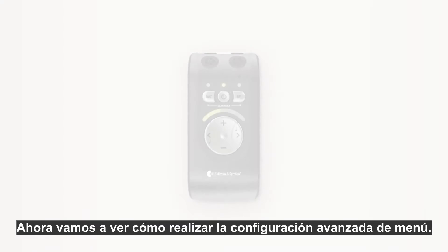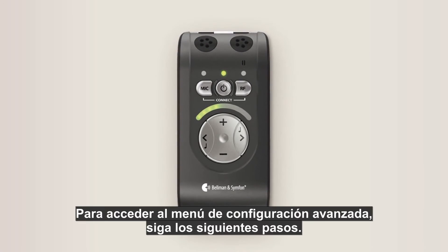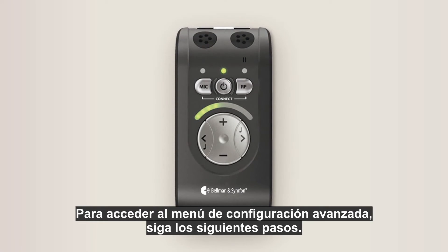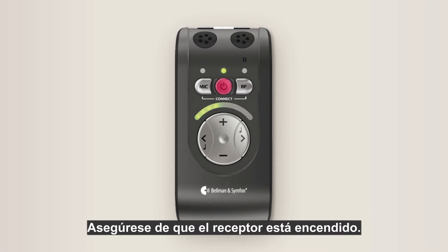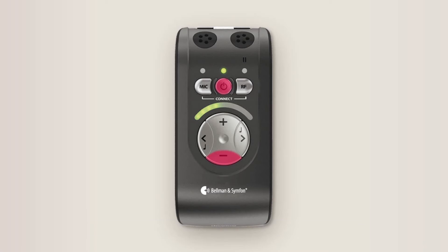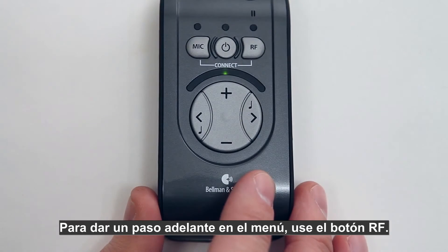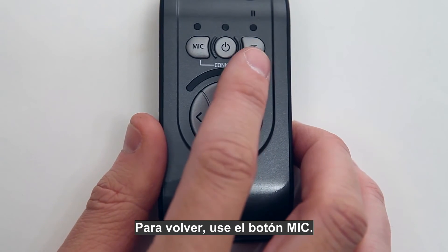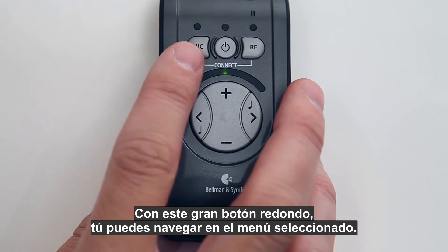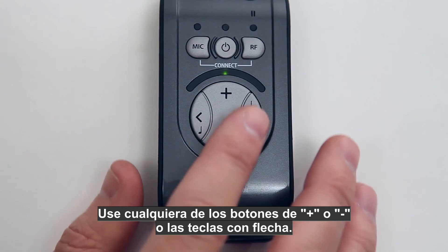Now let's look at the advanced settings menu, where you can further customize your system. To access it: make sure the receiver unit is on, then press and hold the on/off button immediately followed by pressing and holding the volume down button. Keep them held for approximately two and a half seconds and you will be in the advanced settings menu. To step forward in the menu use the RF button; to go back use the mic button. With the large round button you navigate within the selected menu, using either the plus or minus buttons or the arrow keys.